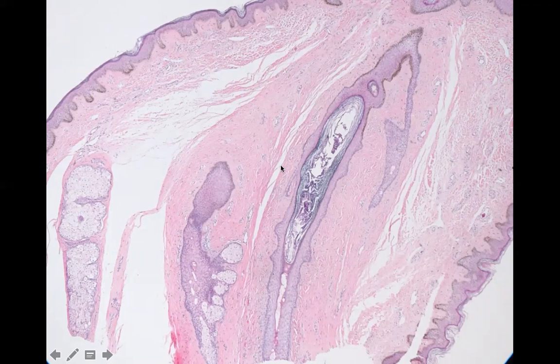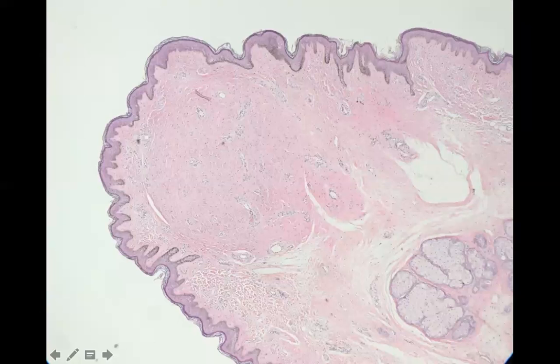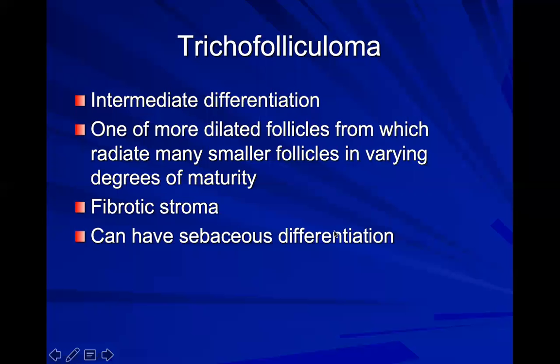But you can imagine if you turn this 90 degrees to the left and cut it, this might be on the side and you might have a central area of fibrous tissue again. So it depends on how you cut it. You have to remember things occur in 3D. But when I see a follicular structure that's a little bit funny in the middle and has little arms coming off, sometimes multiple of these little arms coming off, that's when you call it a fibrofolliculoma. Here's another look at a trichodiscoma from the side, where the ball of collagen is more prominent.